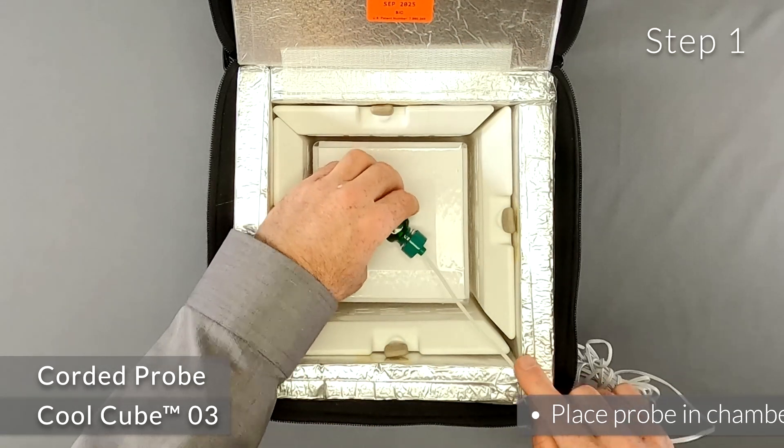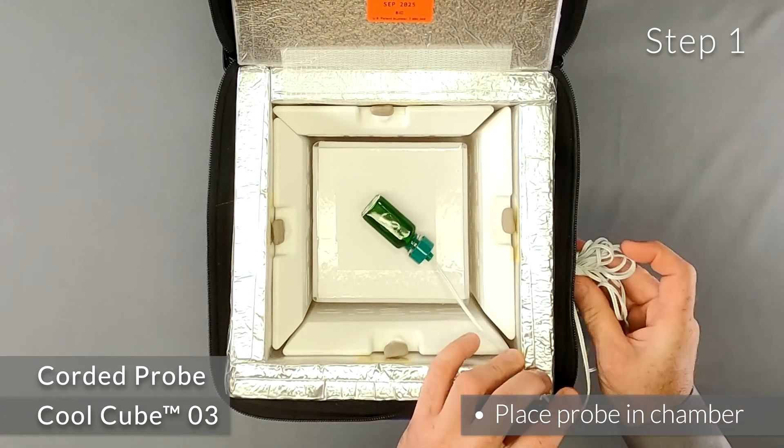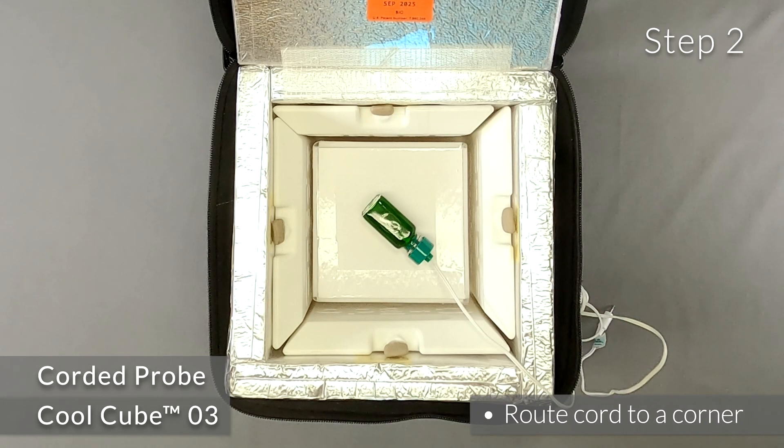Step 1: After packing out the product, place the probe within the chamber as if it were the product. Step 2: Route the cord to a corner of the CoolCube where the panels meet.